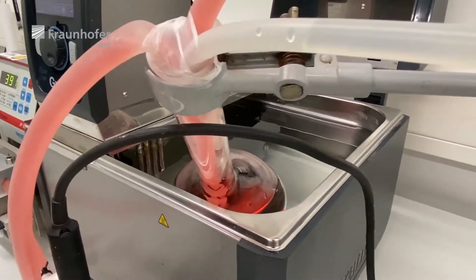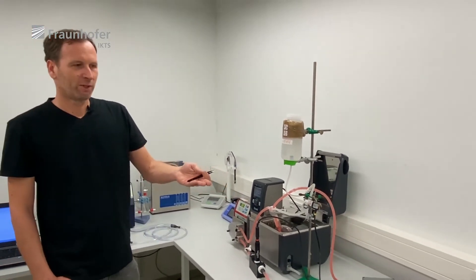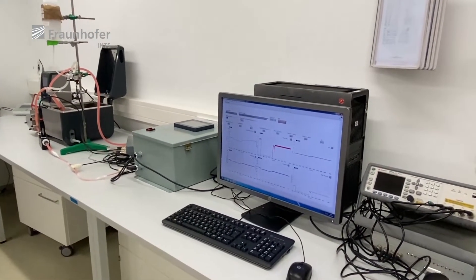This setup runs by itself — it just needs power. Of course, we have a PC attached to monitor the parameters and check whether they drift away or stay constant.